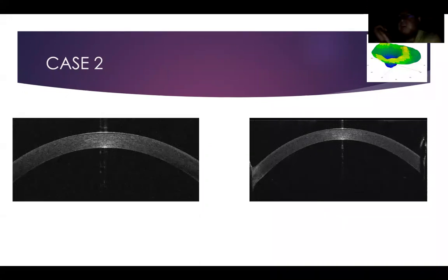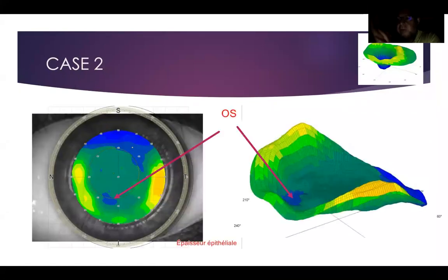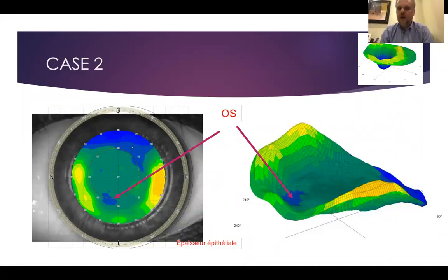Oh, okay, Dr. Yasser, look, we cannot say there is keratoconus without a posterior elevation problem. If the posterior elevation is normal, it is not keratoconus. It's maybe an early one, but we will go. Dr. Yasser, on the basis of the epithelial mapping, you will go for cross-linking for this patient?